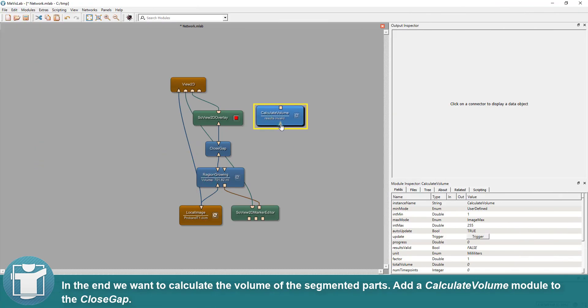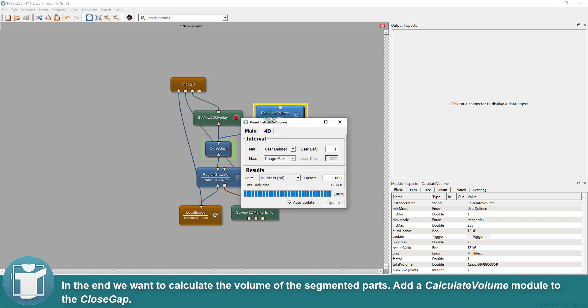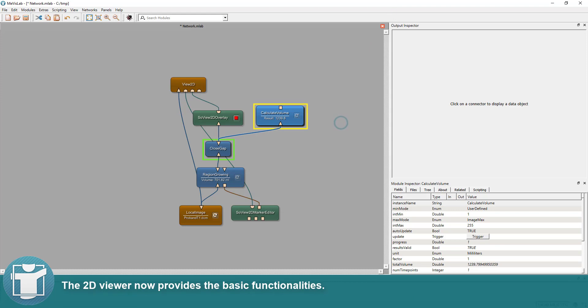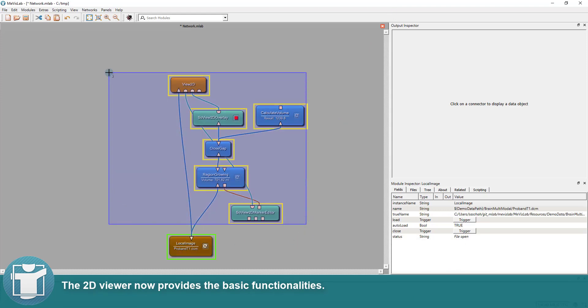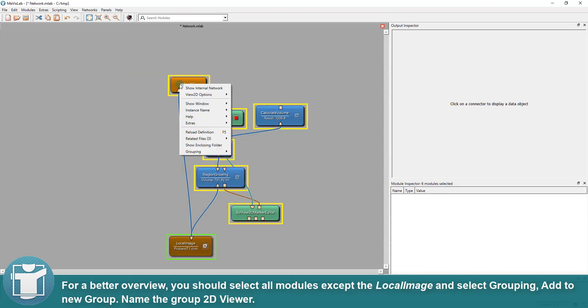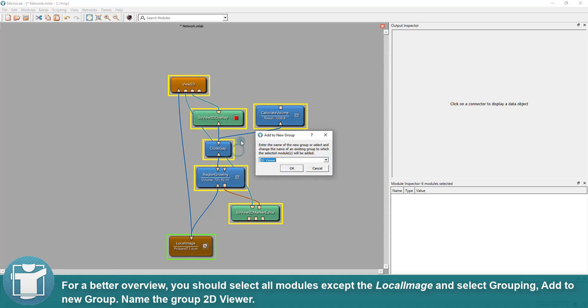In the end we want to calculate the volume of the segmented parts. Add a calculate volume module to the close gap. The 2D viewer now provides the basic functionalities. For a better overview, you should select all modules except the local image and select grouping, add to new group. Name the group 2D viewer.